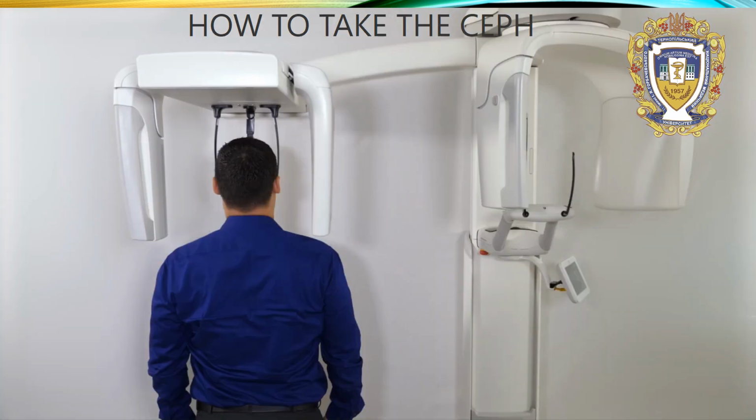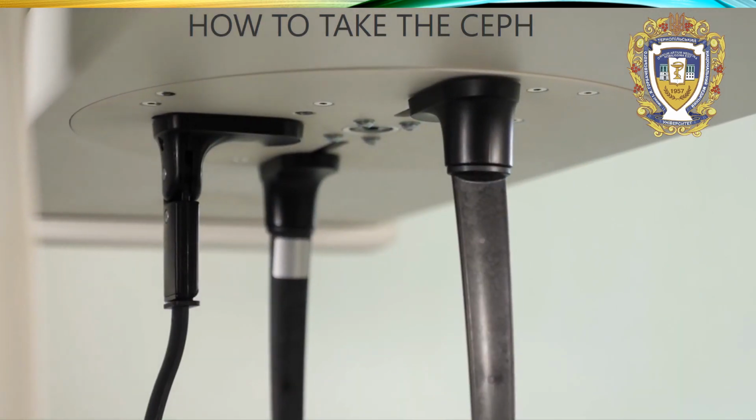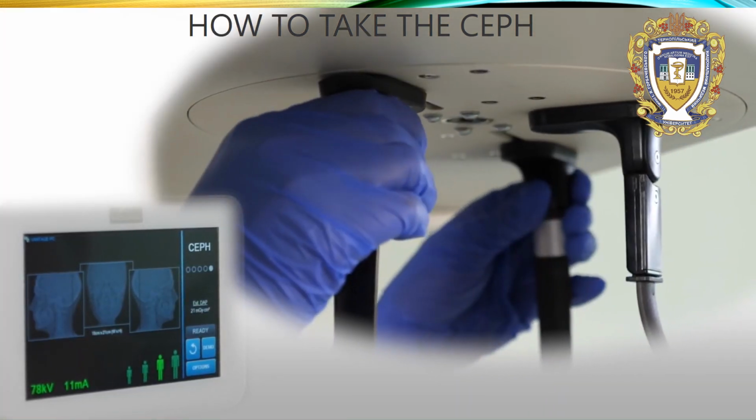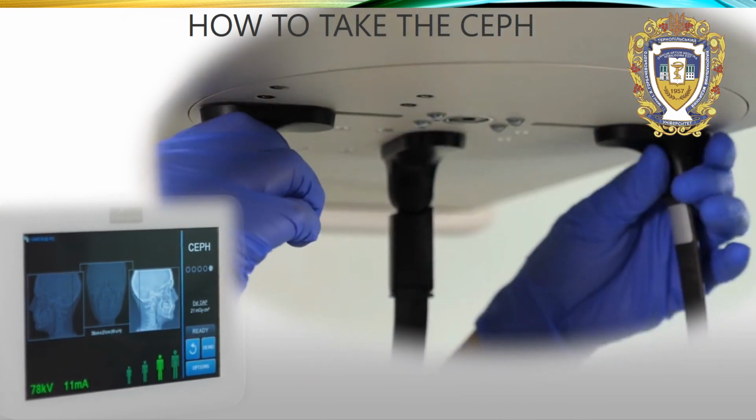And lateral, an image taken from the lateral left or lateral right of the head. The otic posts are in line with the X-ray tube head. Rotate the cephalostat to the proper position based on the desired function or study type. Rotating the cephalostat will automatically configure the system for the chosen cephalometric study type.